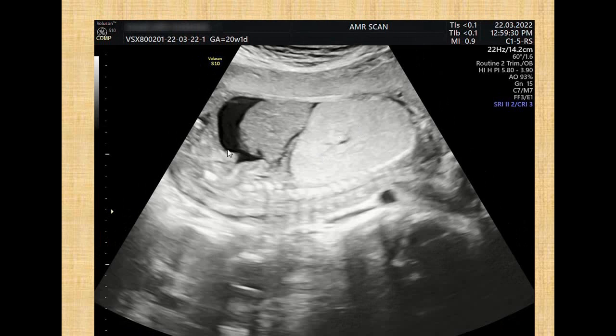Again, you will see the abdominal ascites, but the issue here, we have a sagittal view, and you will see that there are hyperechogenic lungs. And also you will notice that the diaphragm is inverted. Actually, the diaphragm is not in its normal anatomical appearance. It is inverted.